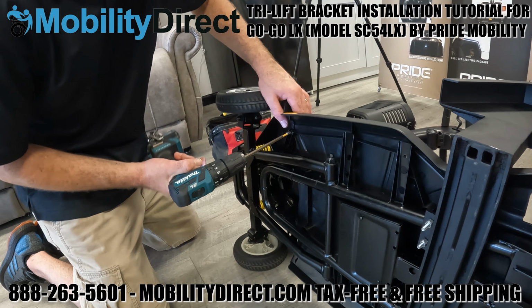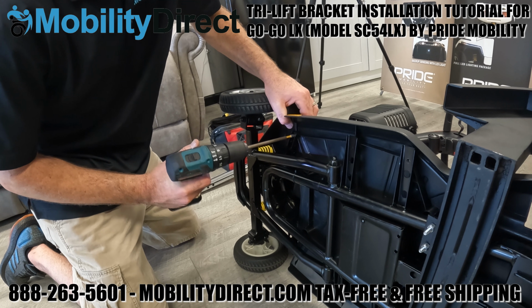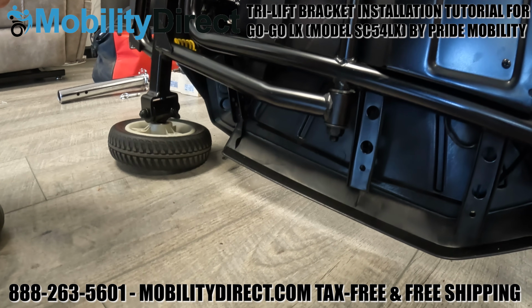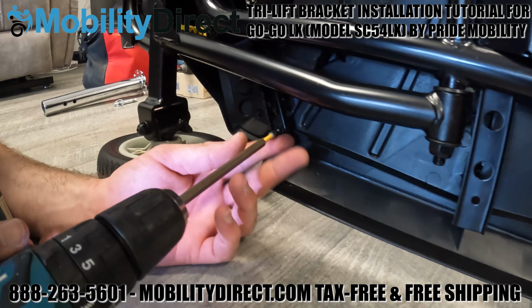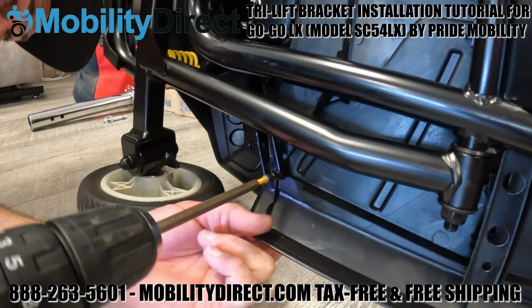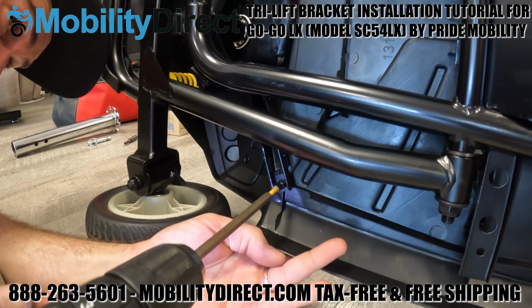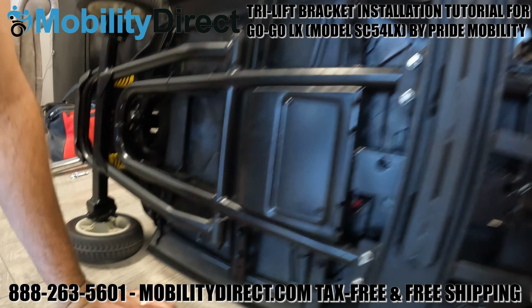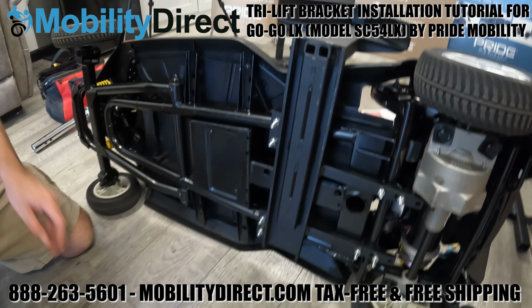And then go ahead and reinsert the screws that you removed from the bottom of the frame, the 2 in the front and the 2 in the rear. You may notice while the scooter is tipped over to the side that it's hard to line up the holes for the screws on the bottom of the frame. So if you do have an extra set of hands, it might help to have someone lift the scooter up from behind while you screw in those bottom 4 screws back into the frame.